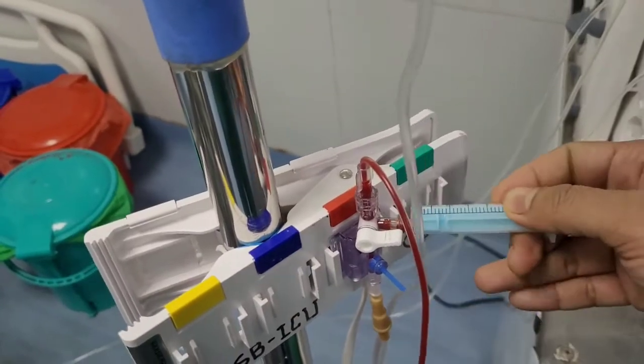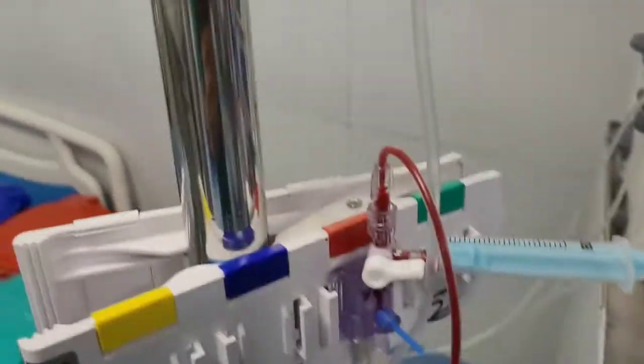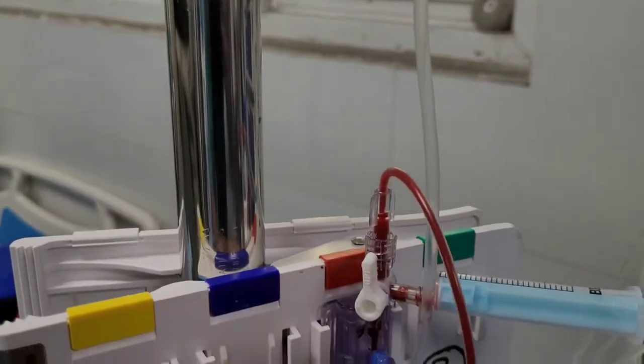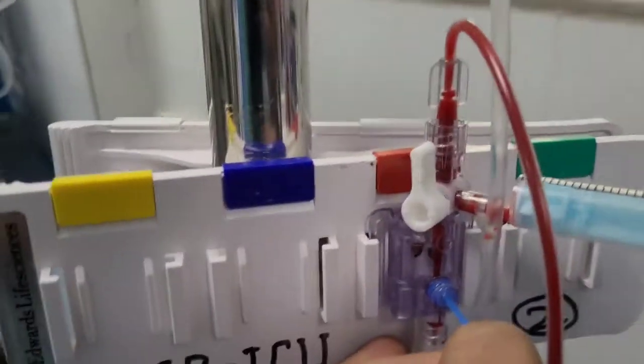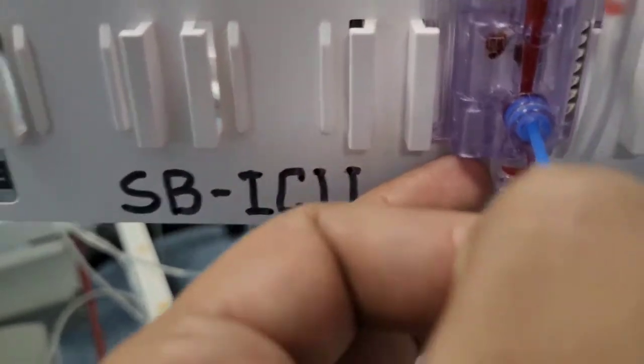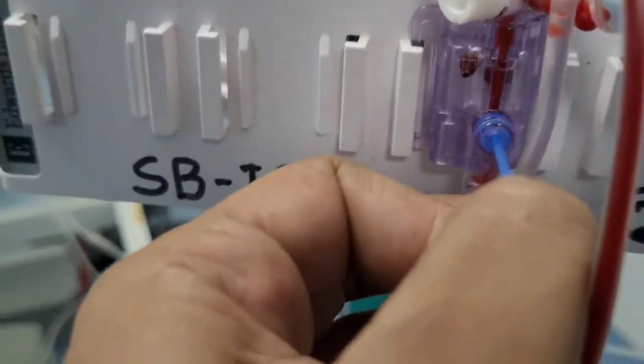Now we will connect this again and load the heparin. For this we have to lift this up and pull this out.